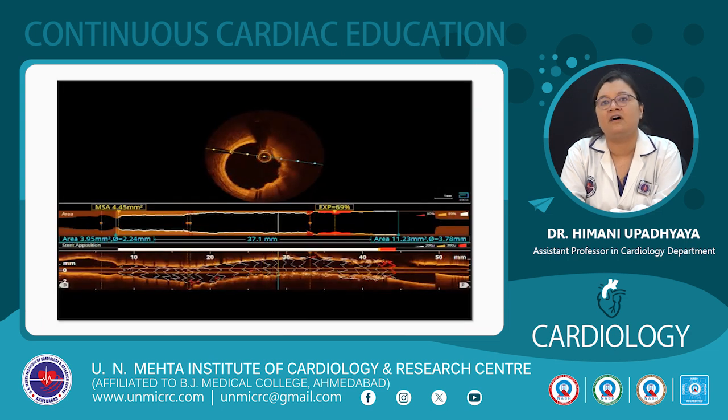And this is an OCT run post-PCI showing well covered struts. The stent is well apposed and well expanded except at the proximal end where the struts are a bit malapposed. It was further treated with an NC balloon.